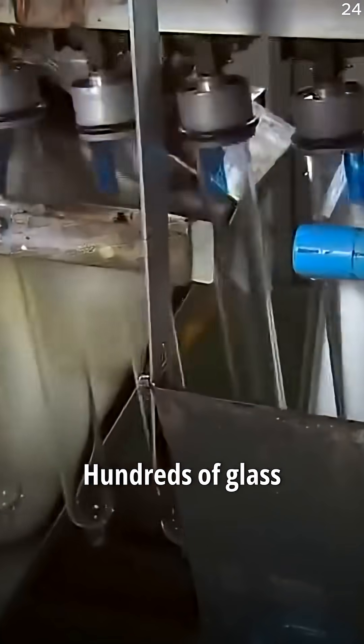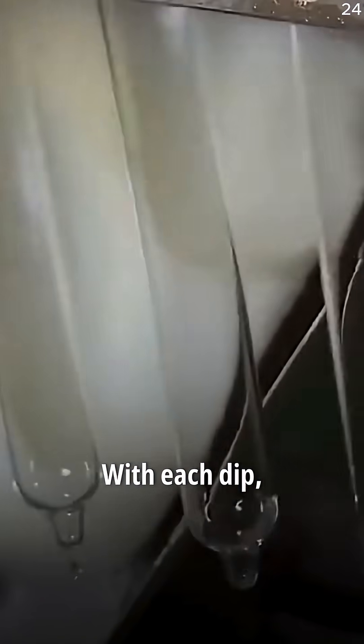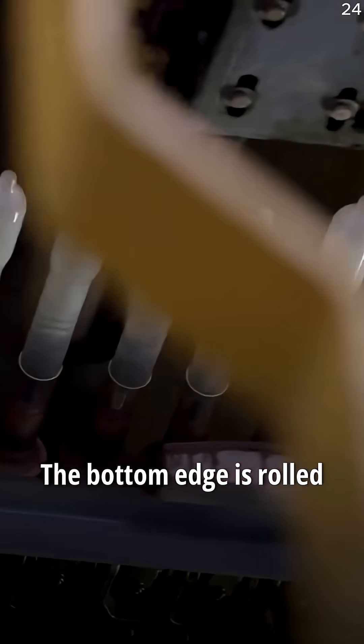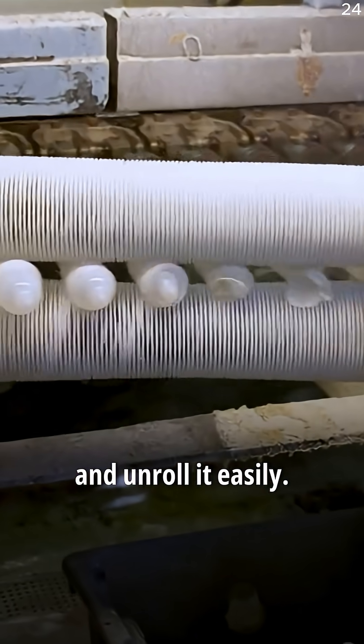Inside these factories, hundreds of glass or ceramic molds are repeatedly dipped into hot liquid latex. With each dip, a new layer forms, creating the perfect thickness. The bottom edge is rolled to make the rim, the part that helps you grip and unroll it easily.